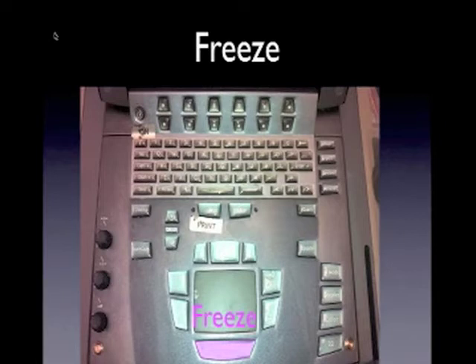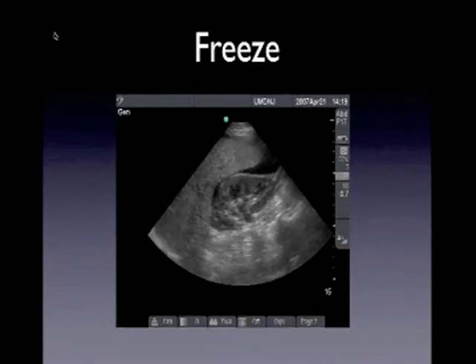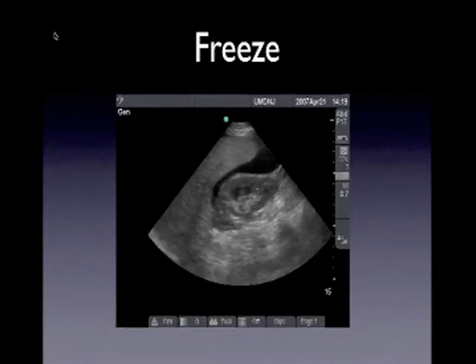The freeze button is pretty self-explanatory. You will use the freeze function in order to freeze your image, to perform measurements or calculations, or to add text.